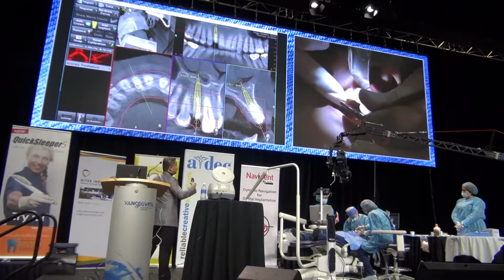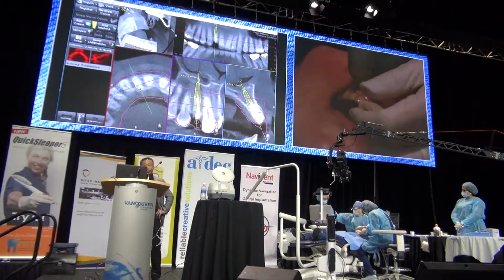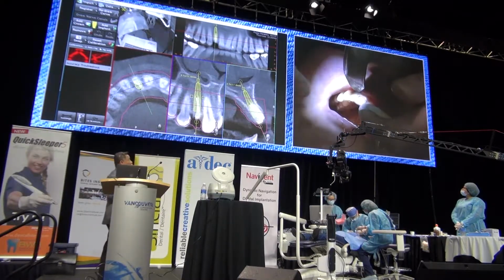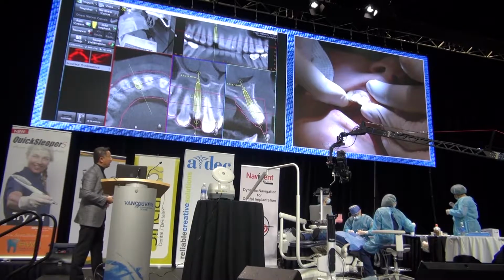Because what you will see is the implant level, obviously the platform and the connection. What you will see is the emergence and or a gap. And the lab can extraorally, without being in the patient's mouth, contour the emergence for that.